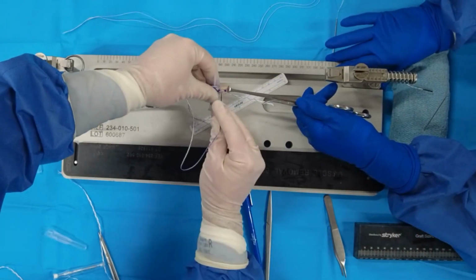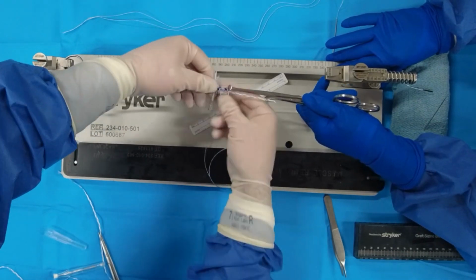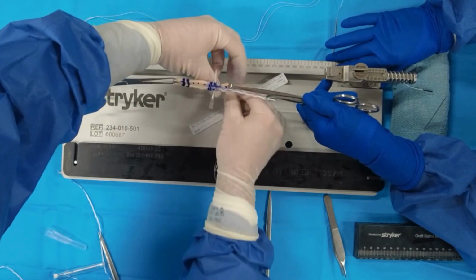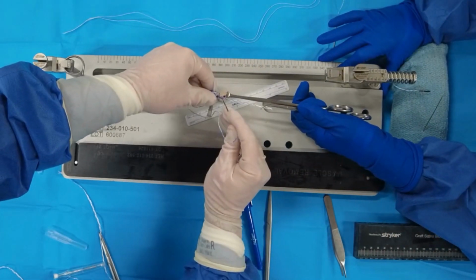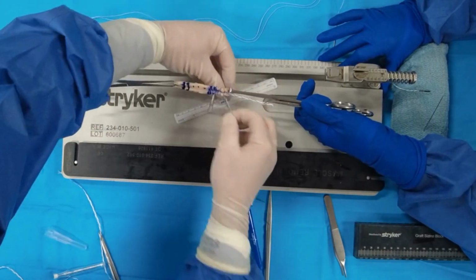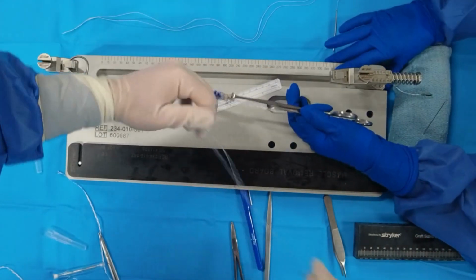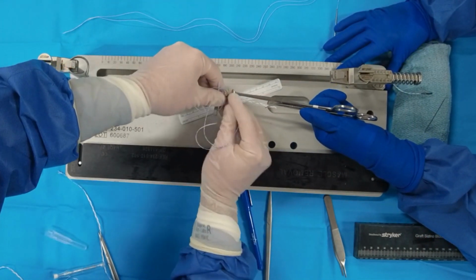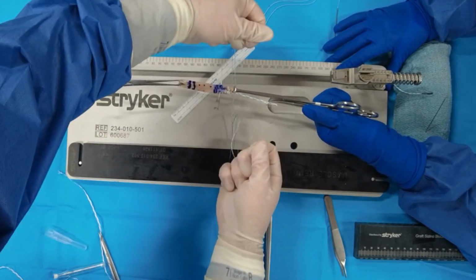In fact, I do put a relatively high amount of force through these last passes just to see if it will, because if it's going to pull out, now is a good time to see it do that, because then we can certainly incorporate that. That's not going to be a problem. But once we get to the end of the tissue, then I'm going to do one more locking suture just to set the whole construct, and in similar fashion just go right behind that last pass as you typically would.